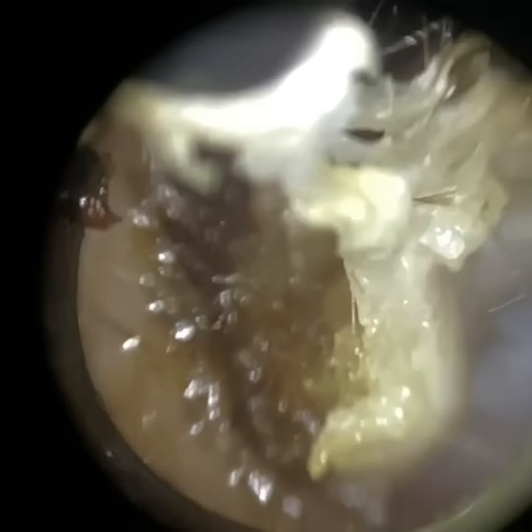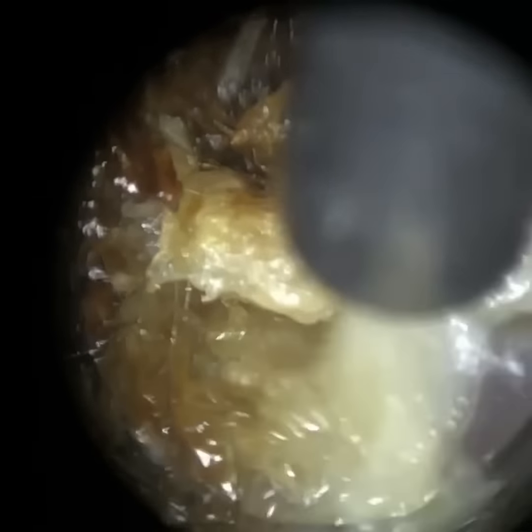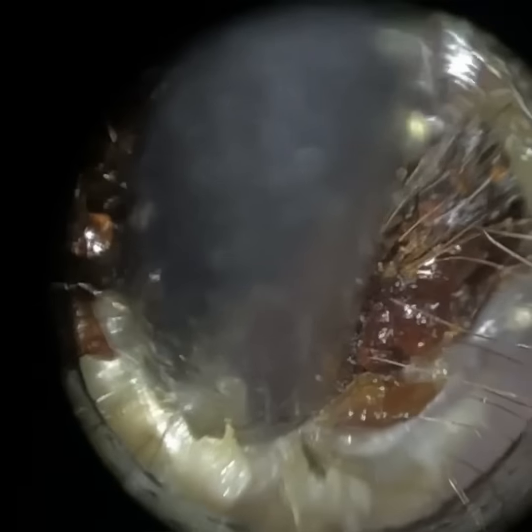I did use forceps. I used the Rycorette as well, which all helped. And there's some residual skin on the eardrum that I also removed using a fine end suction probe. So this suction probe is a 14 gauge suction probe. This is the most common one that we use when performing microsuction. And they typically have an outer diameter of around 2 or 2.1 millimeters, and an inner diameter of 1.6 or 1.7 millimeters.